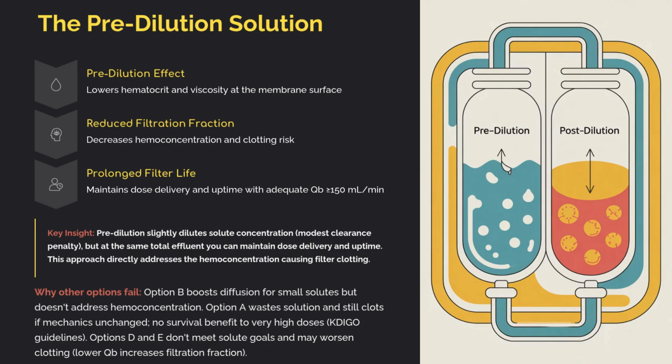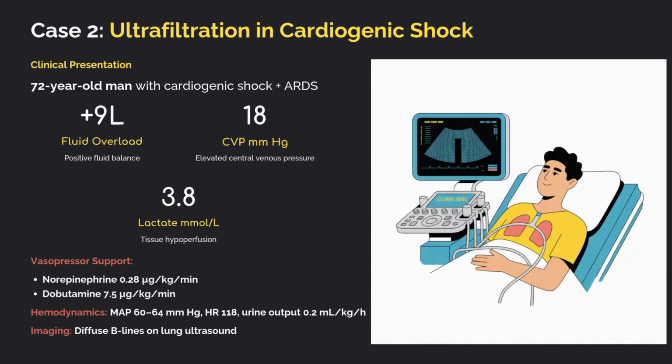So pre-dilution isn't just a technical trick, it's a strategic adjustment that keeps your circuit alive, your dose consistent, and your therapy efficient. Let's move to case 2, ultrafiltration in cardiogenic shock using CRRT.